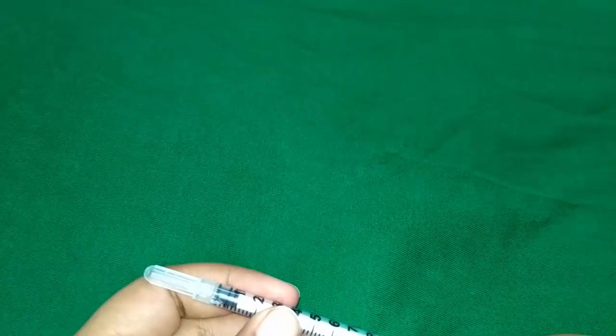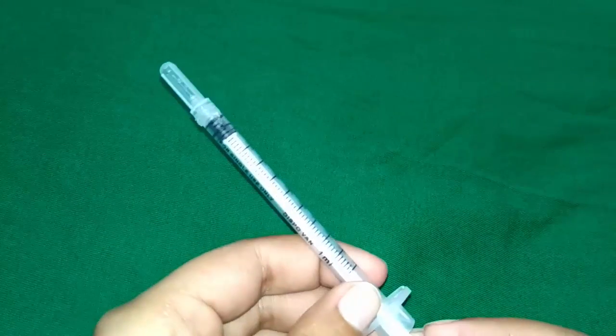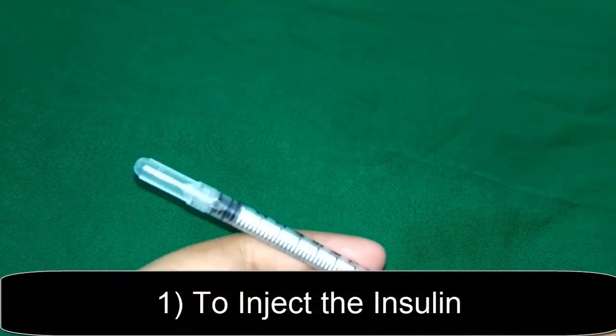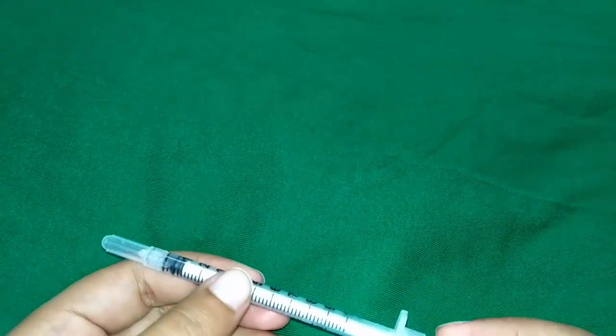Some uses of the insulin syringe: the foremost and main use is to inject insulin. As this is a calibrated syringe, it makes insulin administration very easy.